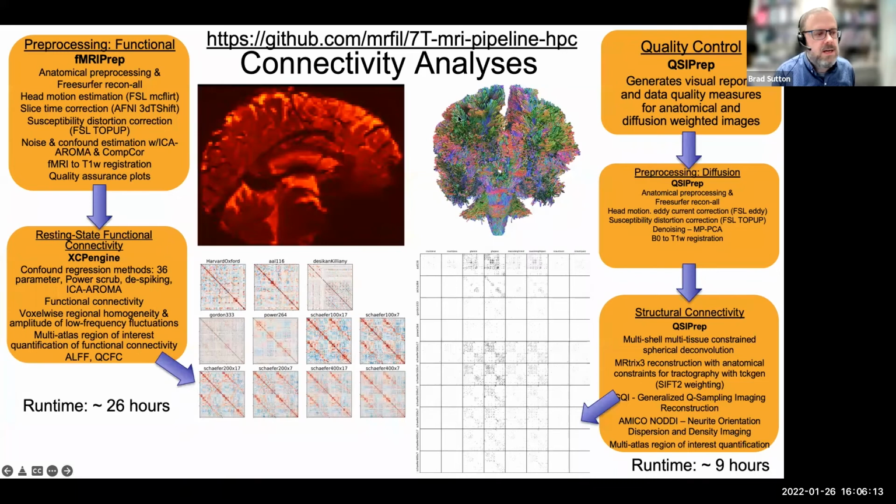Thanks for doing that. We have pipelines that are being developed by neuroscience graduate student Paul Camacho that are being run on everything to produce all sorts of outputs, connectivity maps, and lots of different atlases. And so functional connectivity, structural connectivity, and really leveraging the system, but also applying these techniques to all the data coming out of BIC now at 3T, and really applying this high throughput computation to be able to get all sorts of results so that you know immediately after you scan what the quality of the data was for the purposes that we want.